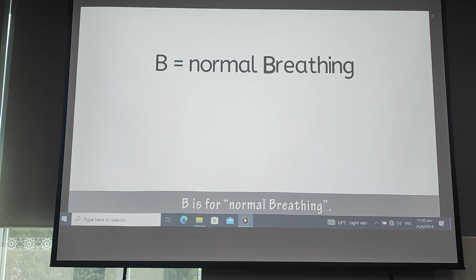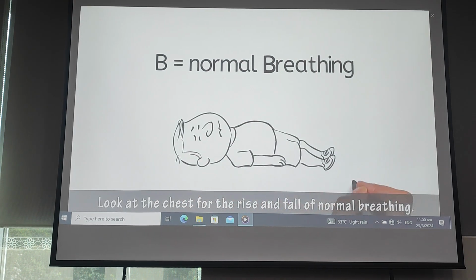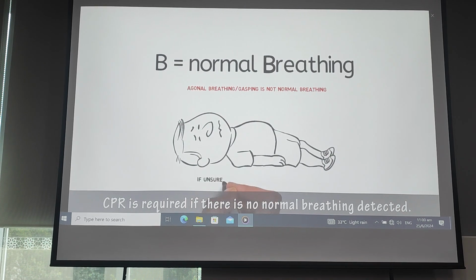B is for normal breathing. Look at the chest for the rise and fall of normal breathing. Agonal breathing or gasping is not normal breathing. CPR is required if there is no normal breathing detected.